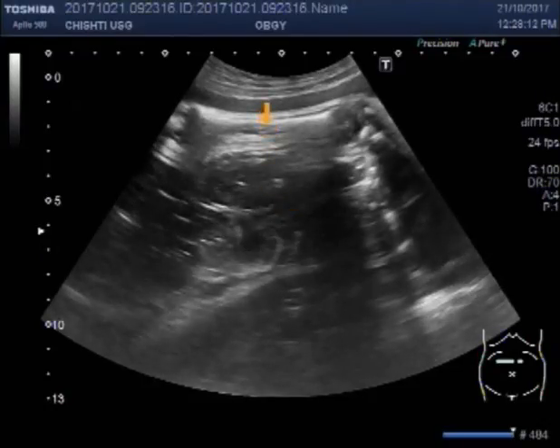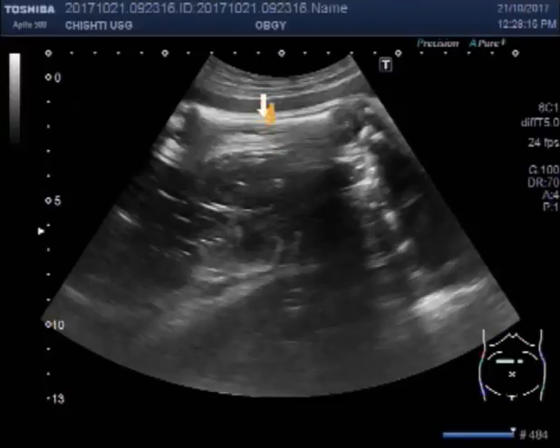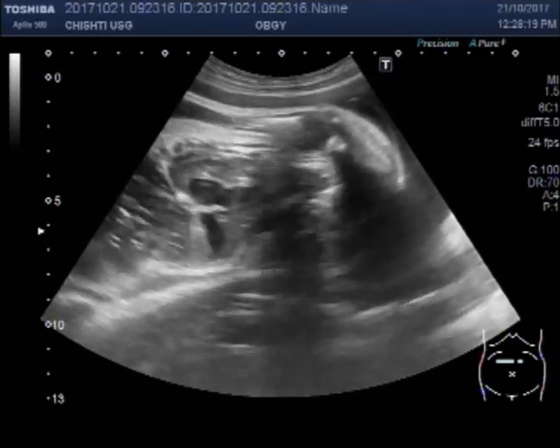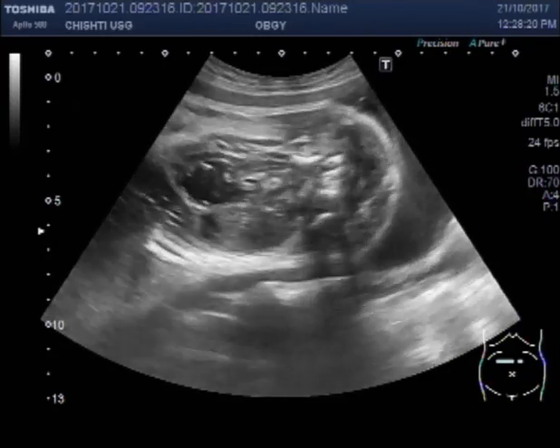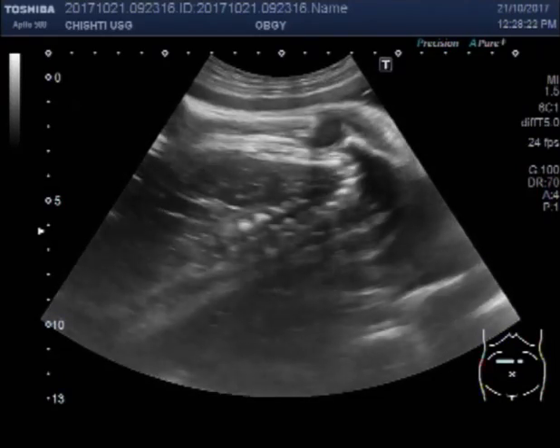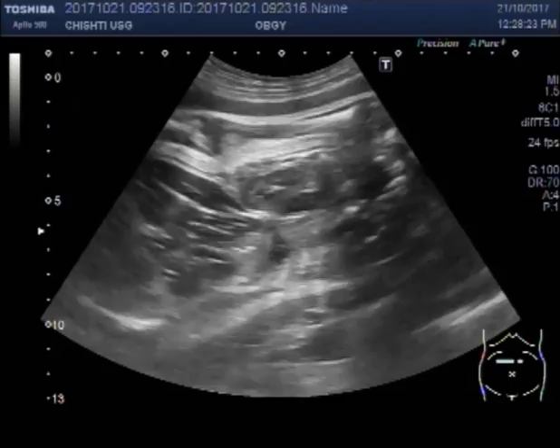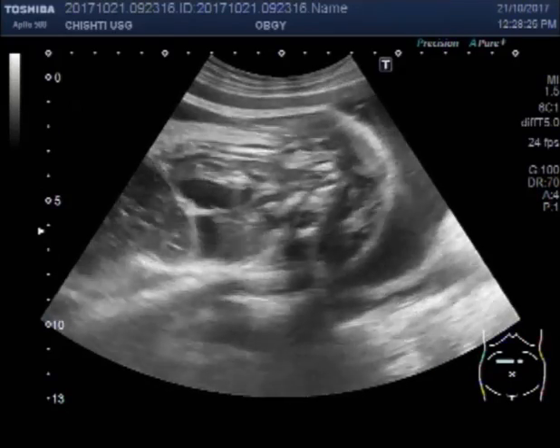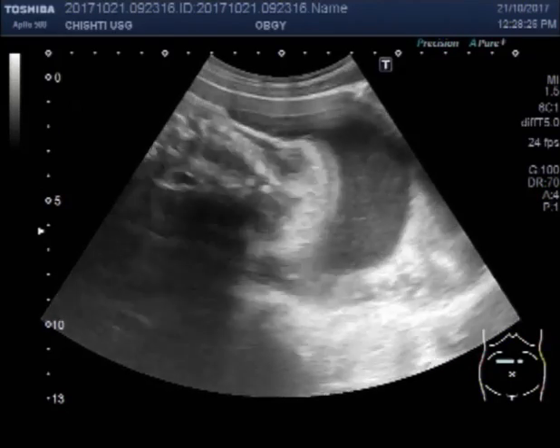This is the female fetus. Again you can see the heart now.